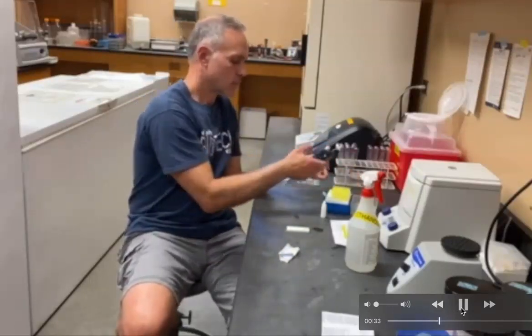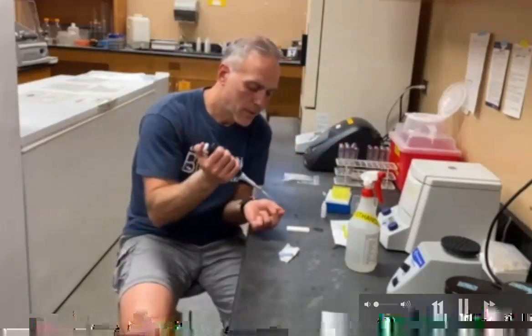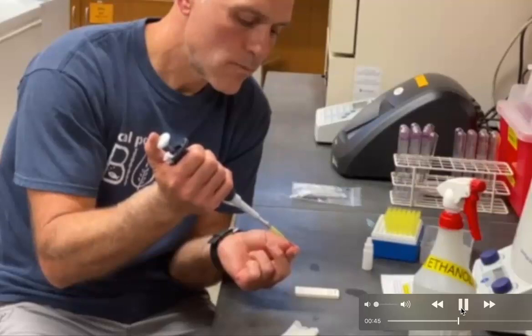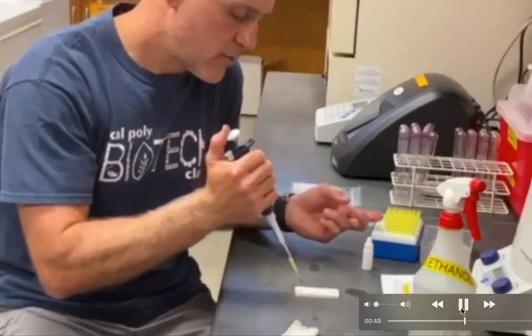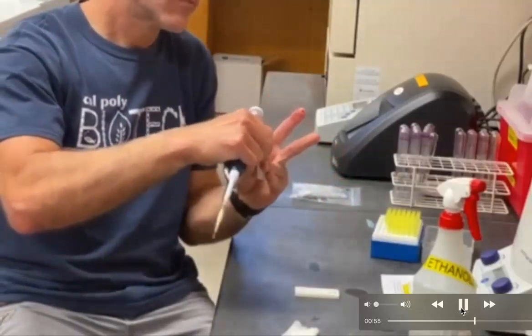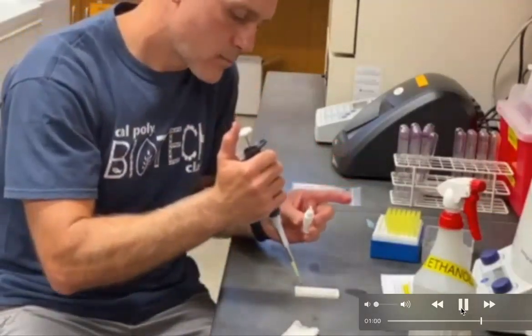And I'm going to use a micropipette to draw out about 20 microliters of blood that I can apply to the sample wells of the cassette in front of me. And that little dropper bottle contains the buffer. It's going to push my blood sample across the conjugation pad.